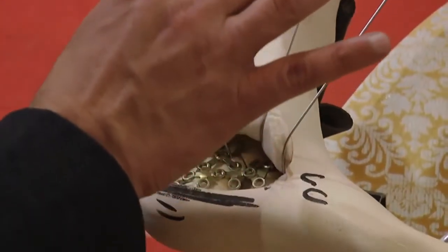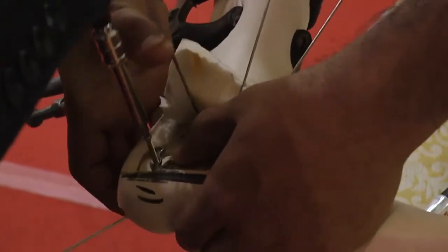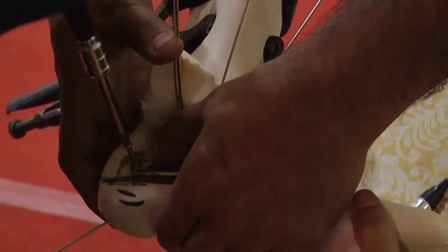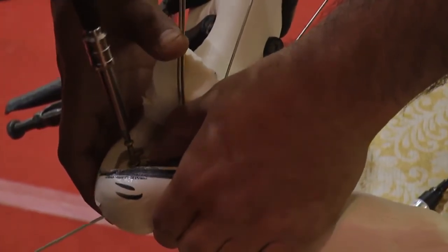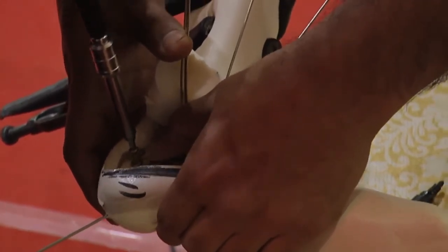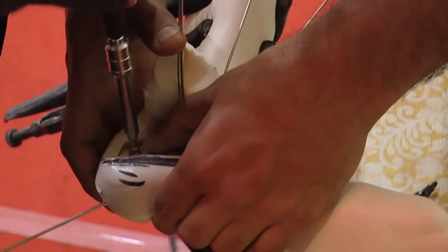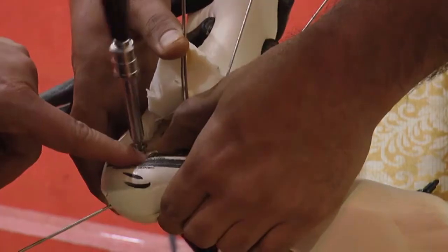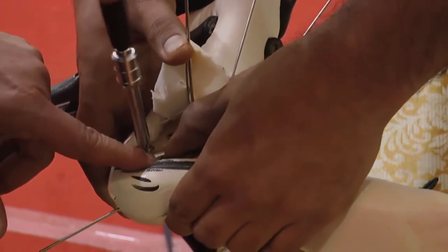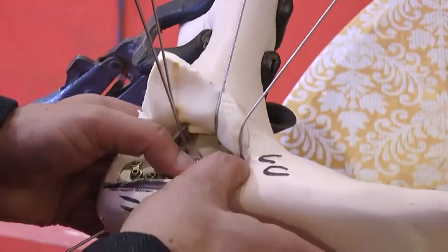Generally, I will put a screw out of the plate in the direction of this wire that we just showed. So that gives you more confidence that your lateral facet has been stabilized and will not move while you're fixing with the plate. And sometimes it's possible to put another screw, the sustentacular screw, also through the plate, which gives you a better hold because the screw head does not sink into the bone. If it is into the plate, it gives you a better purchase. So that stabilizes your plate onto the bone.